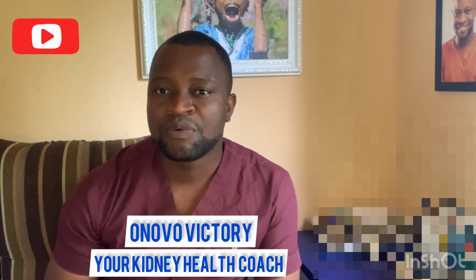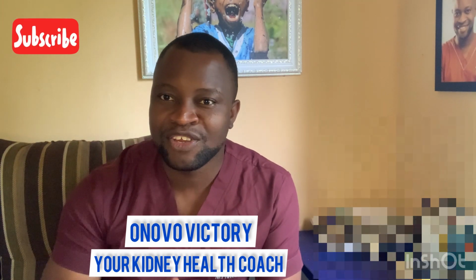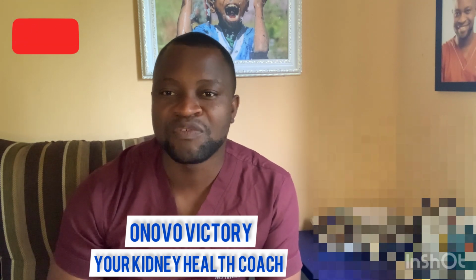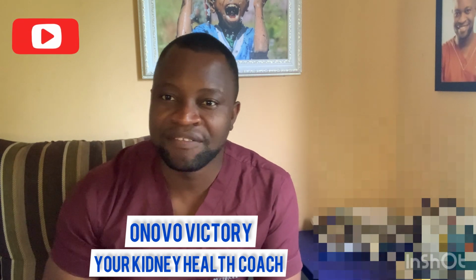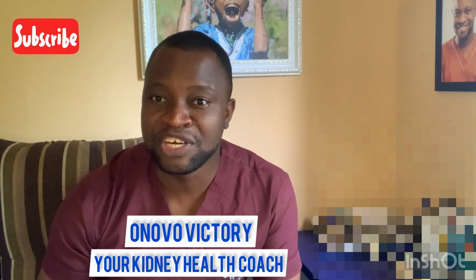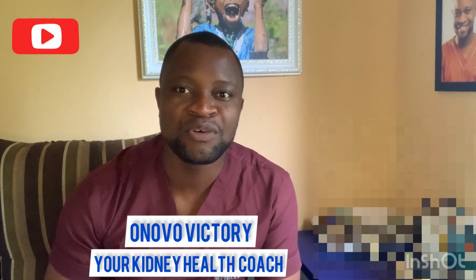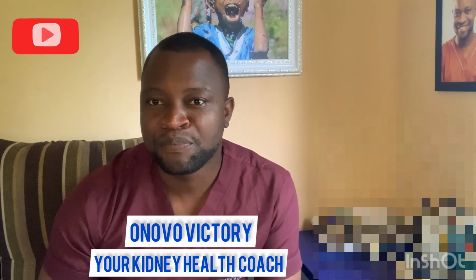Whenever you check your sugar, you have to write down what you've gotten. Pen down everything. Like what we say in the hospital, whatever is not written is not done. If you did not write it, how do we take reference? How do you know that you're managing your blood sugar level properly?